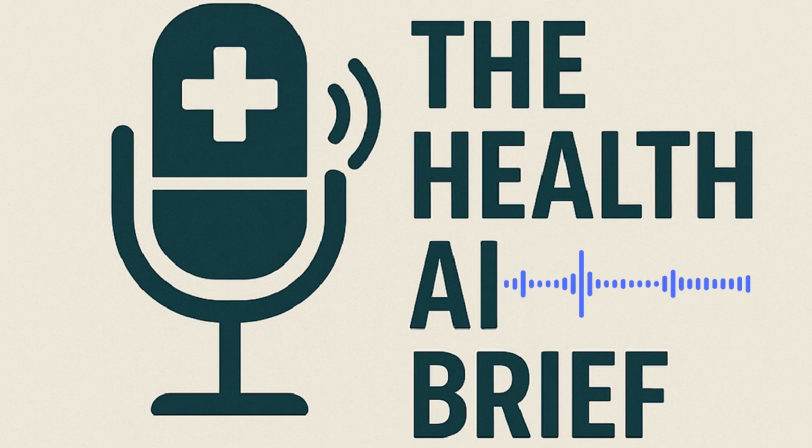If you're a radiologist, a pathologist, or a dermatologist, this is the episode that matters most to your specialty, most likely. When we talk about AI beating humans at spotting breast cancer on mammograms or identifying melanoma on dermoscopy, we're almost exclusively talking about convolutional neural networks, or CNNs. But how does a computer actually see? It doesn't have eyes, it sees a grid of numbers, pixel values. The challenge is, how do you turn a grid of 5 million numbers into a diagnosis of pneumonia?